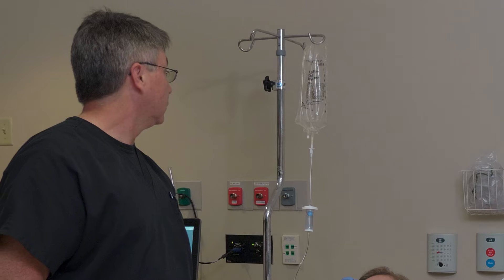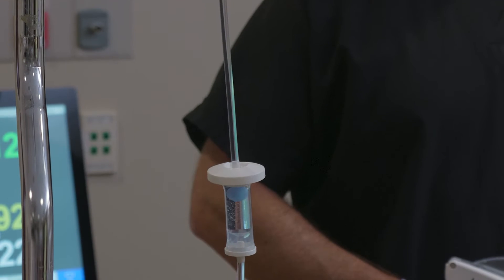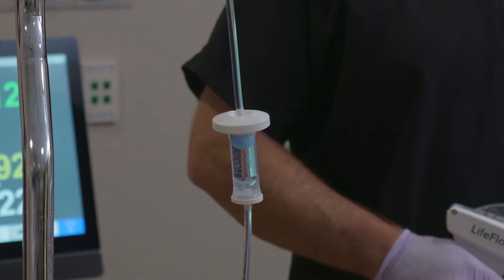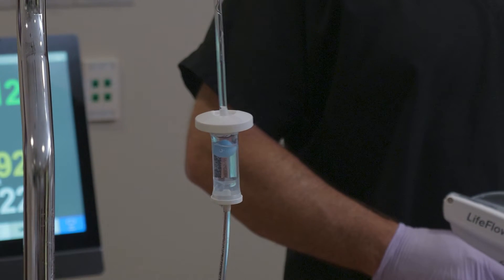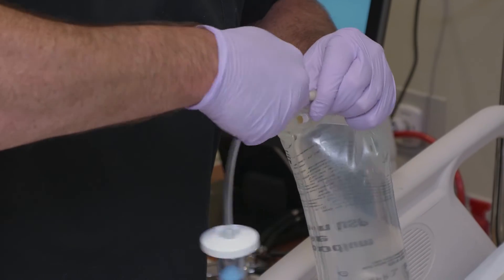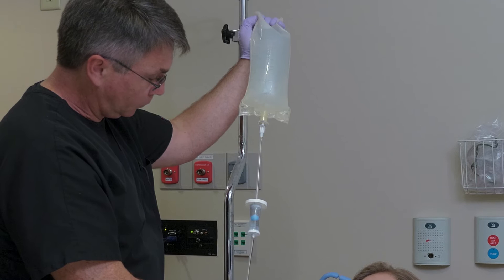Monitor the fluids throughout the infusion and stop infusing before the bag is empty. You should always stop infusing if the level of the air check ball starts to drop — this is an indicator that you're out of fluid. Connect a new fluid bag, allow the air check to refill, and then resume infusion.